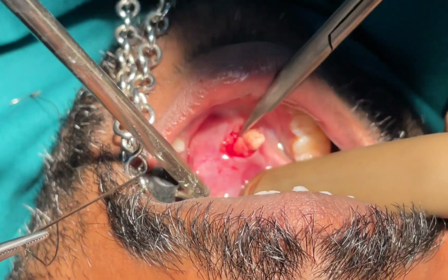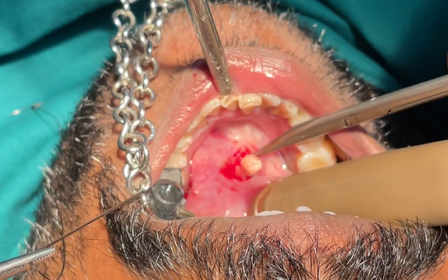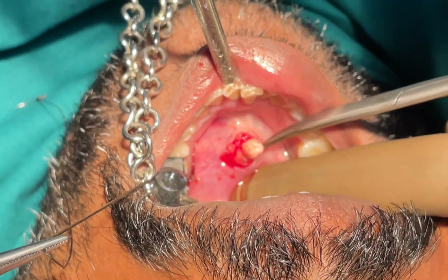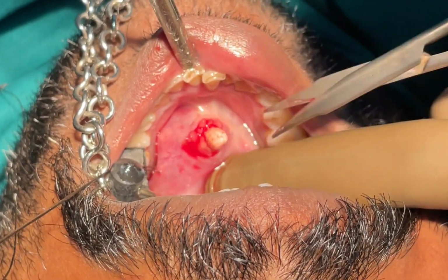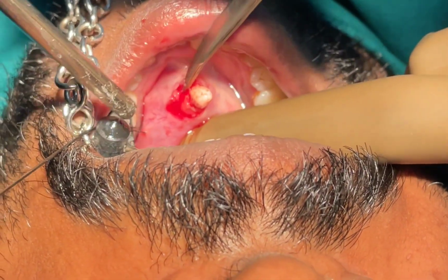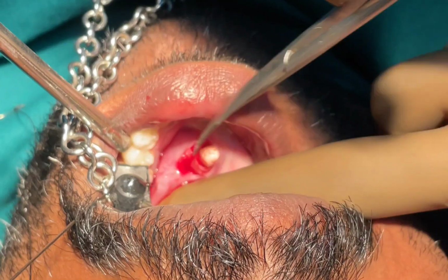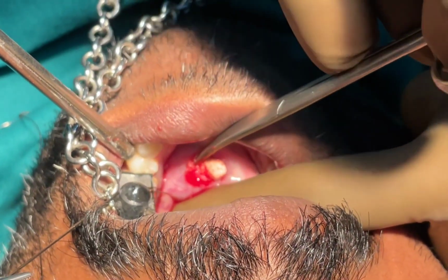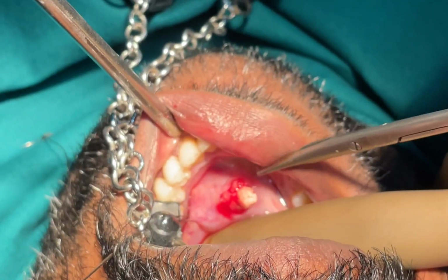And then after your incision, you can start dissecting the stone, and you can use sharp dissection initially where you can dissect the stone and try to expose the entire stone. So now you can see that the stone is being dissected in and around circumferentially with the dissecting scissors.